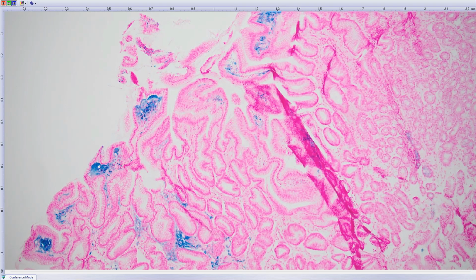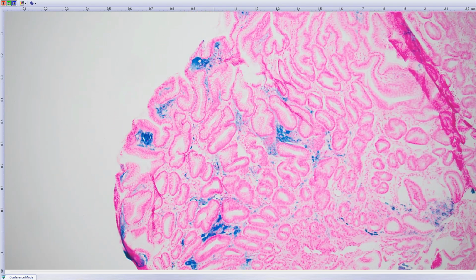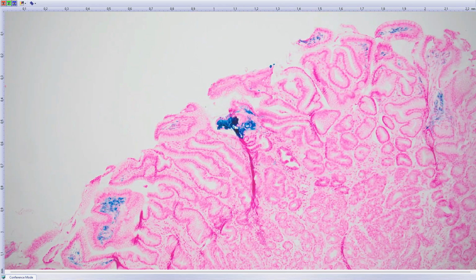This is caused by drugs, supplementation of iron, because the gentleman has got anemia, okay? And in addition to his anemia, now he's got erosions and problems with his stomach.